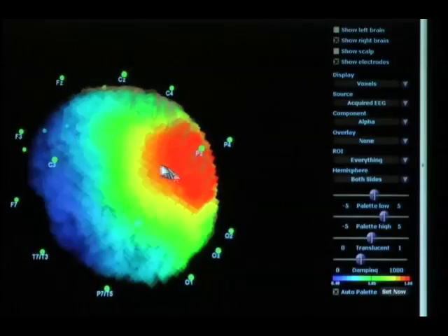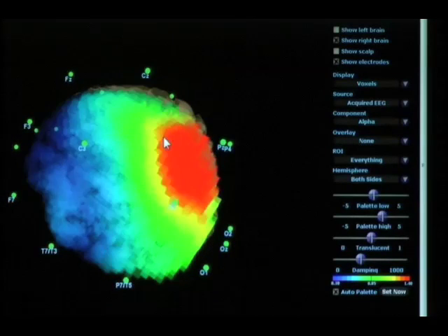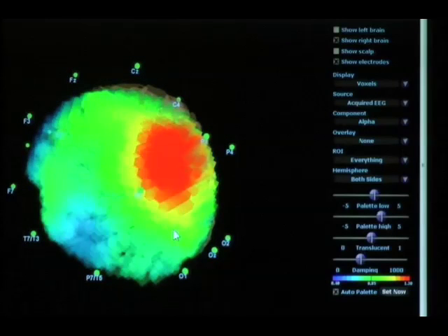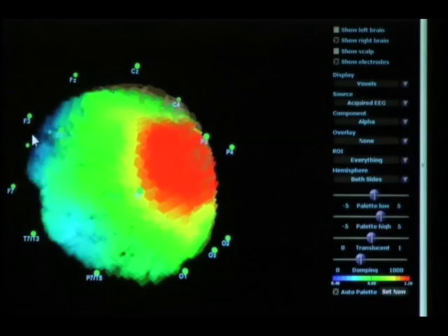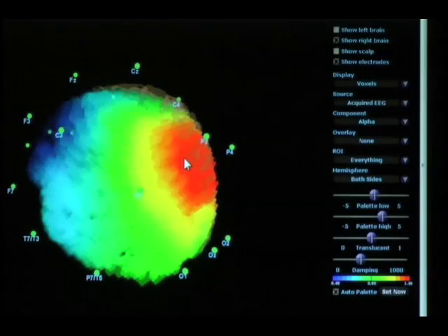Now we're going to look at the palette controls in the Live LORETA projector. This is one area where we definitely seem to have some confusion and questions. It's actually a simple concept which I will explain. When we look at a three-dimensional image like this using color encoding, we need to define the levels at which the colors begin and the colors end.